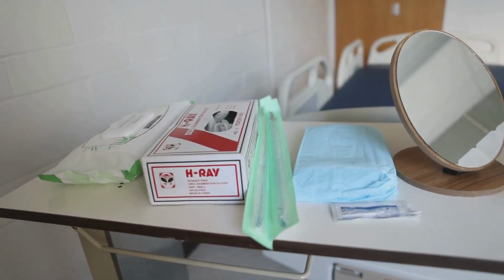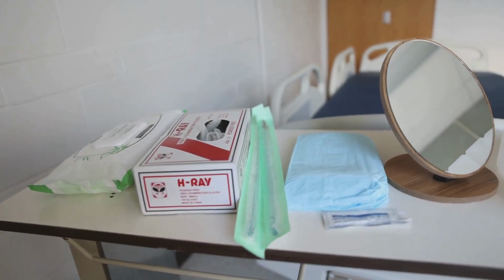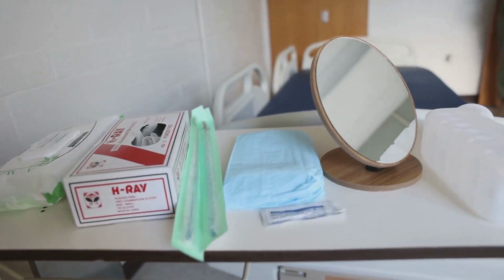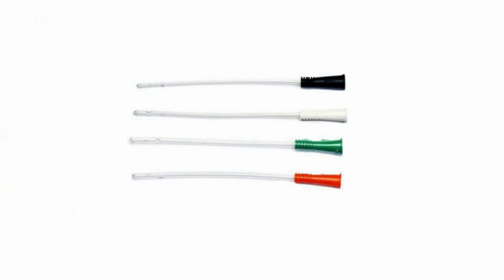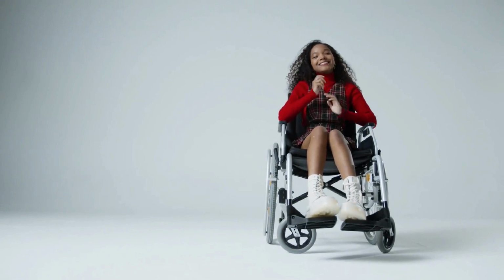Understanding your own preferences can help you choose the best catheter type and determine the physical positioning that works best for you during self-catheterization. You may find that a specific catheter style or size is more suitable, or that a particular insertion angle or body position works best for you. The more familiar you are with your body, the better equipped you'll be to make these choices.